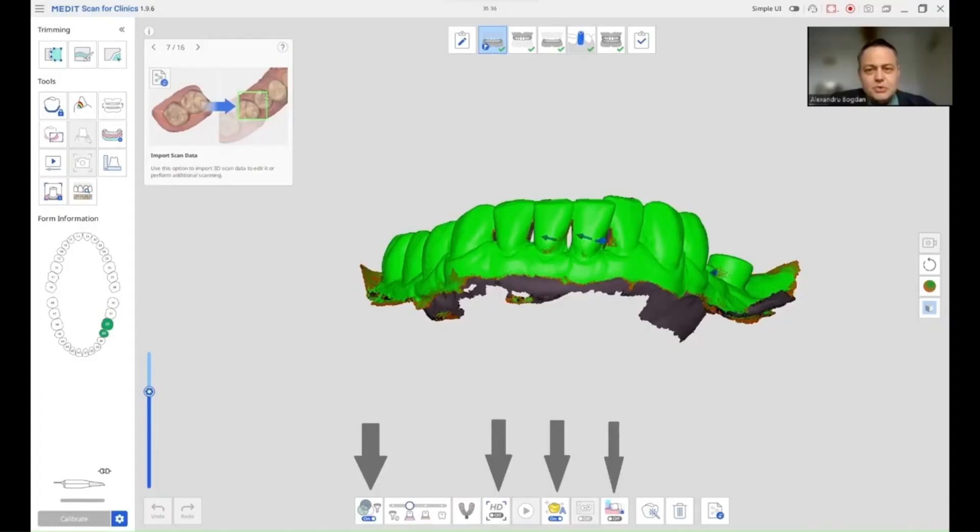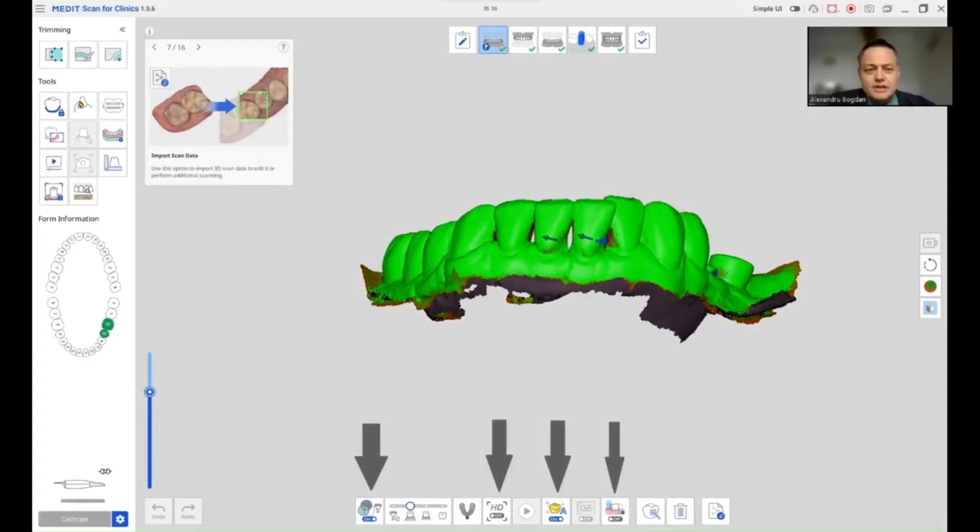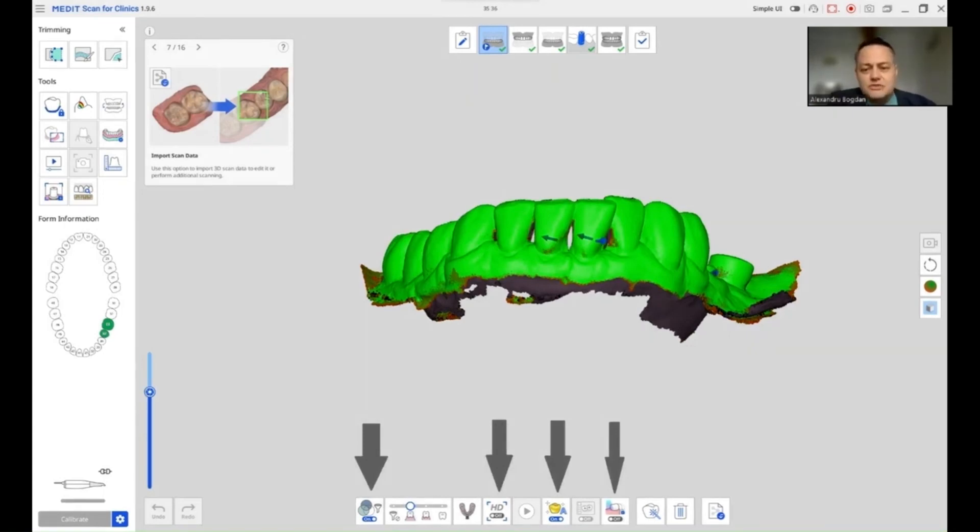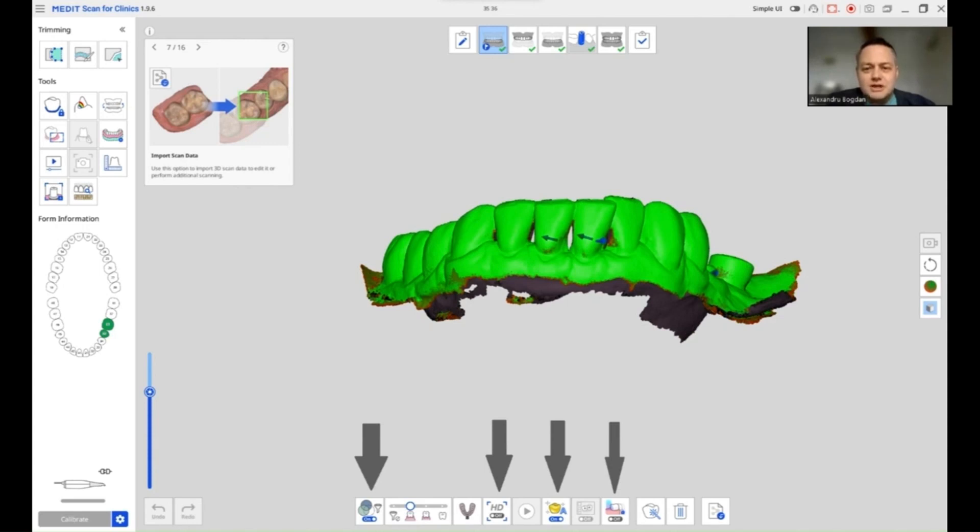For the scan to work correctly, I want to have the following stages. I want to have a pre-op stage of the working arch, an antagonist, a working stage, the scan body stage, and the occlusion stage. This is why I'm going to have the next options checked.